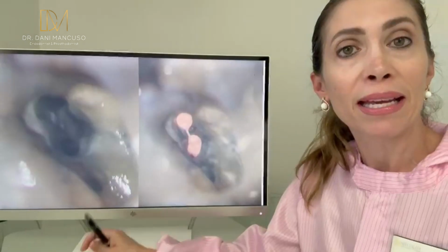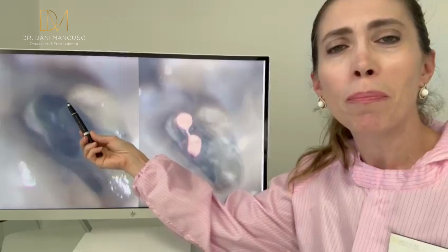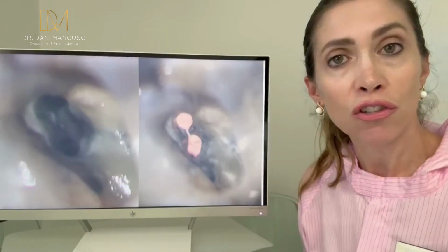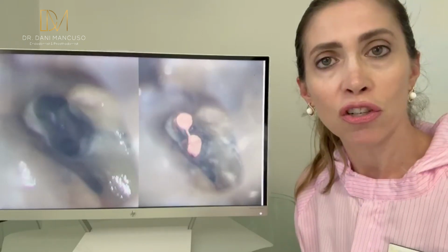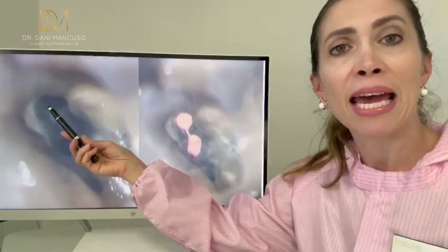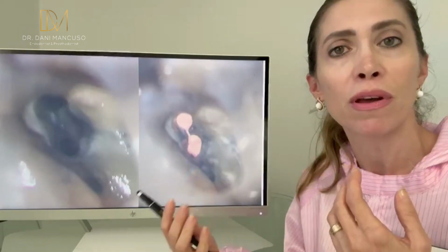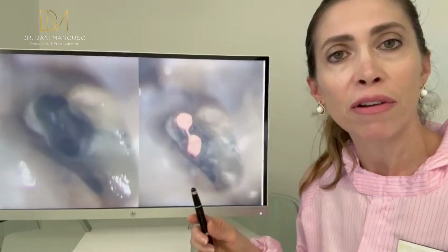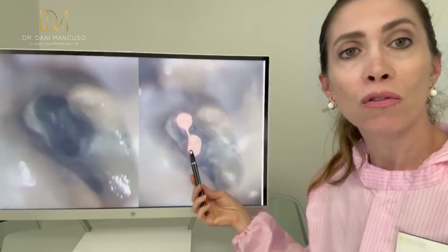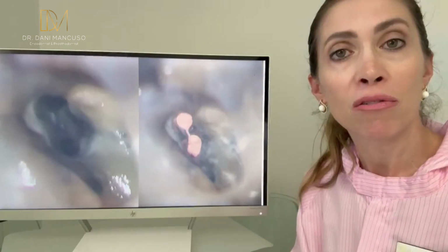If you go back and see the preparation and now the obturation, don't forget to use plenty of irrigation, alternating, at the very end, sodium hypochlorite, EDTA, and sodium hypochlorite. Make sure the pulp chamber is always full and always flush a lot. You can use the new EndoActivator. I really like that. It comes with the light cure as well, so it's very good. It flushes everything out. And once that is all clean, then you can dry your canal, GP point, and the bioceramic sealer.